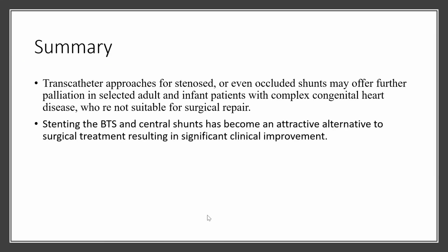In summary, transcatheter approaches for stenosed or even occluded shunts may offer further palliation in selected adult and infant patients with complex congenital heart disease who are not suitable for surgical repair. Stenting the BT shunt and central shunts has become an attractive alternative to surgical treatment, resulting in significant clinical improvement.